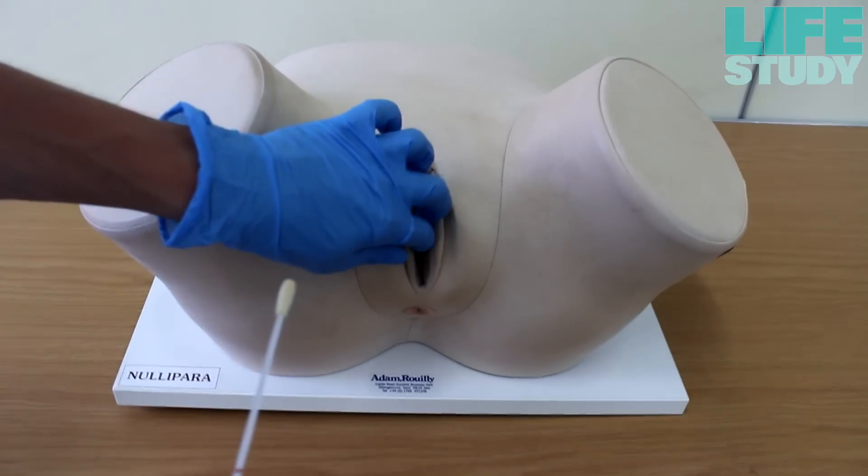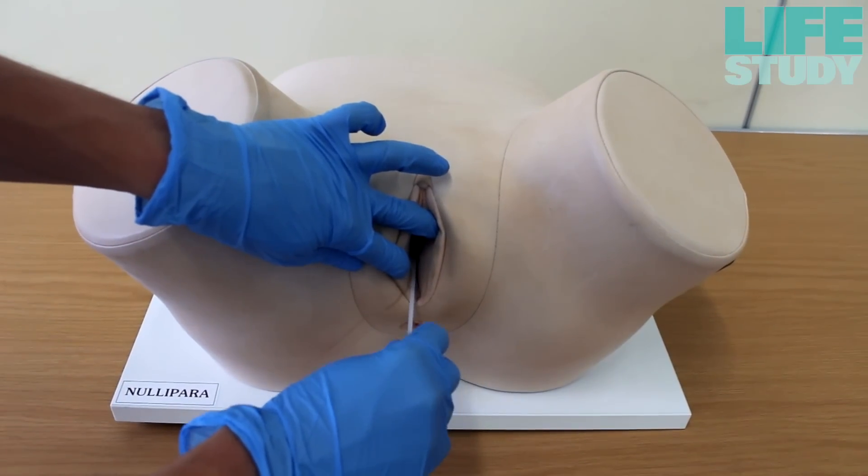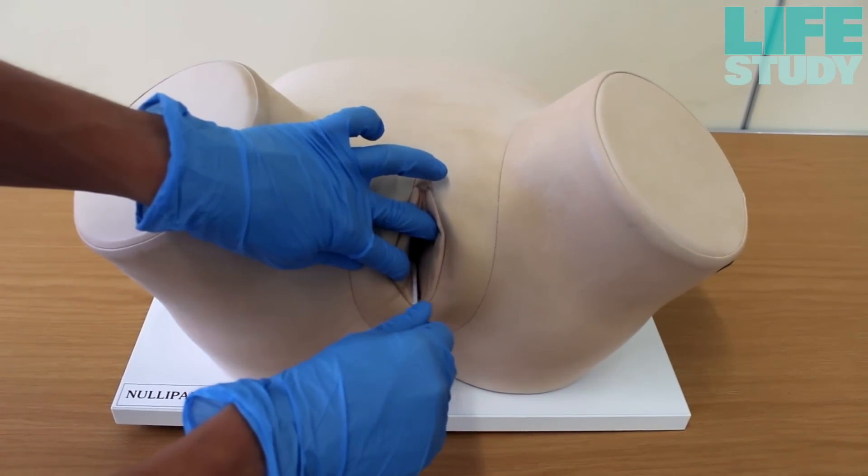Opening the labia first, insert the swab two inches into the vagina. Be careful not to touch the swab on any other surface. Rotate the swab several times.